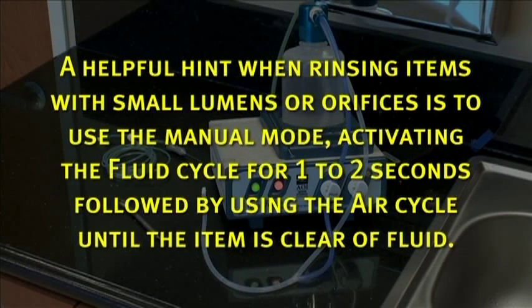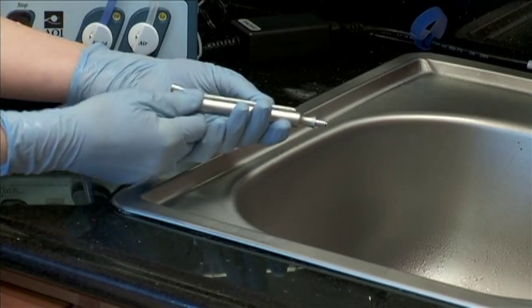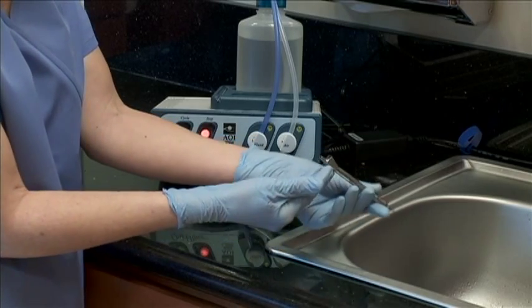A helpful hint when rinsing items with small lumens or orifices is to use the manual mode, activating the fluid cycle for one to two seconds, followed by using the air cycle until the item is clear of fluid. Now inspect the rinsed item for cleanliness before sending to autoclave. If you have more than one item to be rinsed, reconnect the instrument interface tubing to the next item or channel.